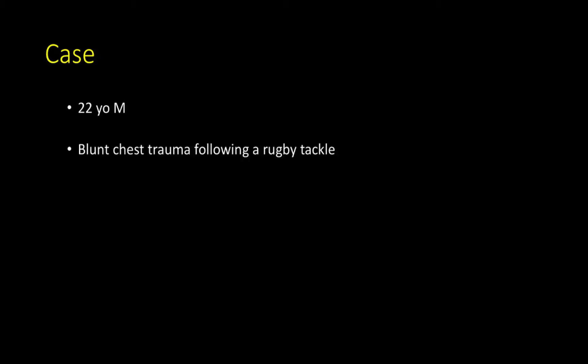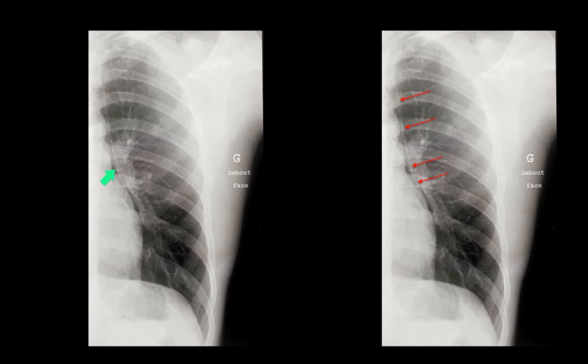I'm going to discuss a case of a 22-year-old male, previously fit and healthy, who received blunt chest trauma following a rugby tackle. On the chest radiograph you can see the thin line represented by the parietal pleura, which has been stripped from the mediastinal surface by gas between the mediastinum and the parietal pleura.